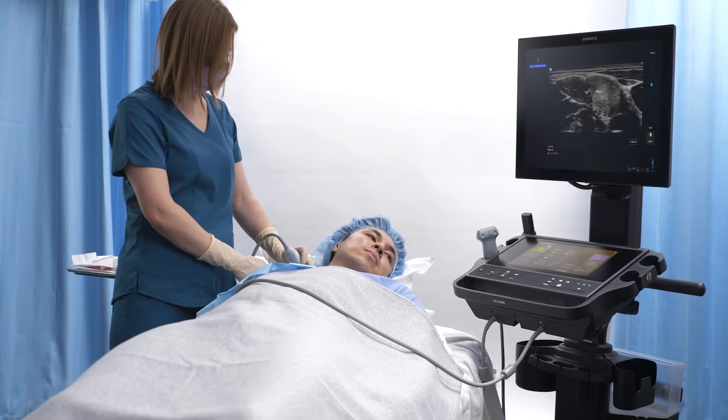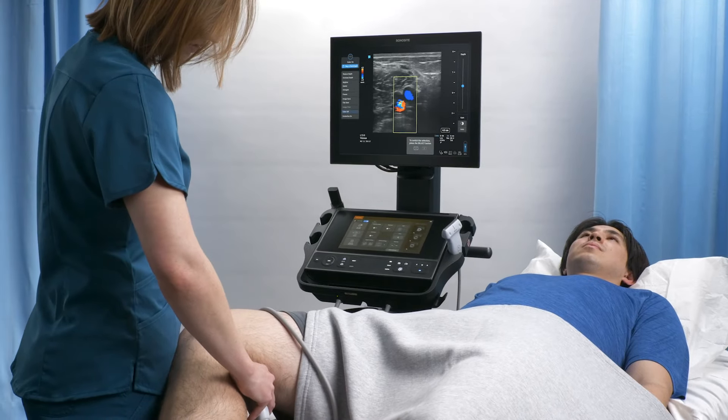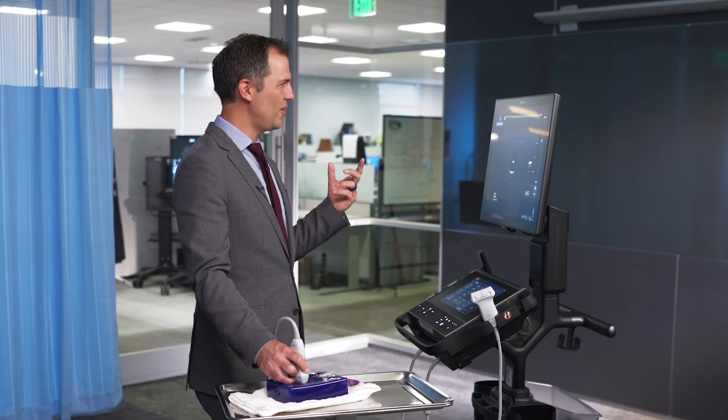So that's SonaSight right there. With Voice Assist, focus on what matters most — your patient's care. When you think of voice activation, you want it to be super responsive and super reliable. That's what this is.